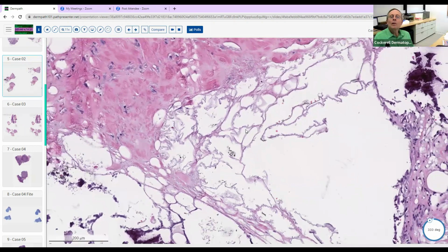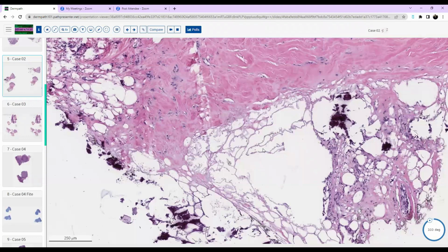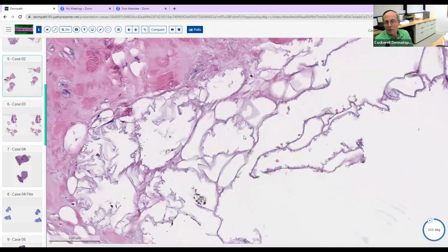It is a lobular panniculitis, correct, and it doesn't really have much inflammation here. Usually it's seen in situations where there isn't a lot of inflammation, and it's usually associated with kind of a low-grade ischemia, if you will. So we see it most commonly in lipodermatosclerosis, right? Yes. Patients have chronic stasis dermatitis, and they get the inverted Coke bottle or champagne bottle type leg. You biopsy it and you see this, but it's not pathognomonic of that.